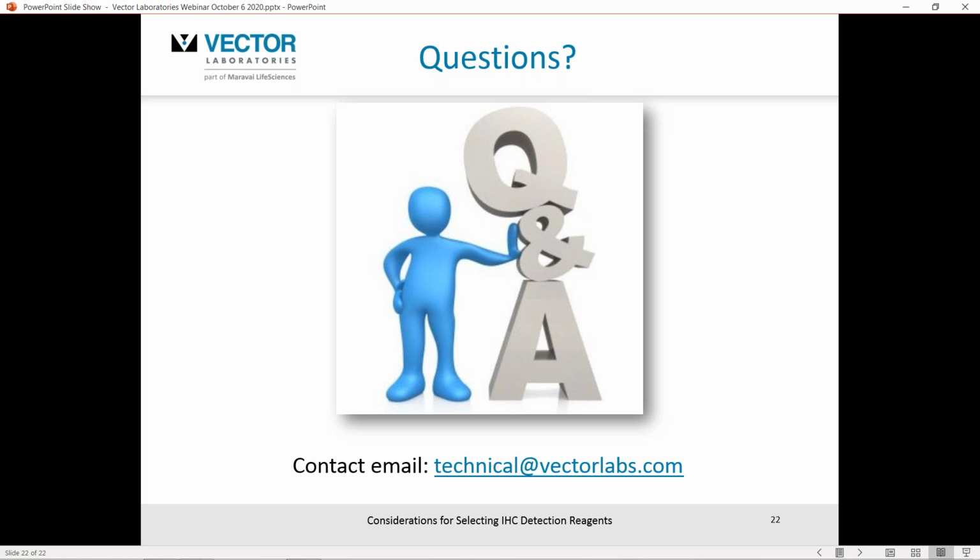It would certainly be very different for immunofluorescence, so just take note of that, but that's generally what we'd recommend. Indeed, in the presentation earlier on, I did show an example of 2 HRP substrates, I believe DAB and Vector VIP. They were actually performed using 2 mouse monoclonals, if I remember correctly. So it just gives you a bit of an idea, and they were in very close apposition to each other. So certainly sequential labeling would be recommended.